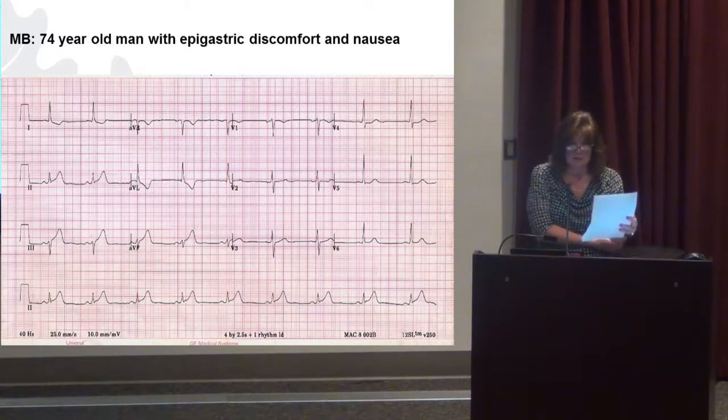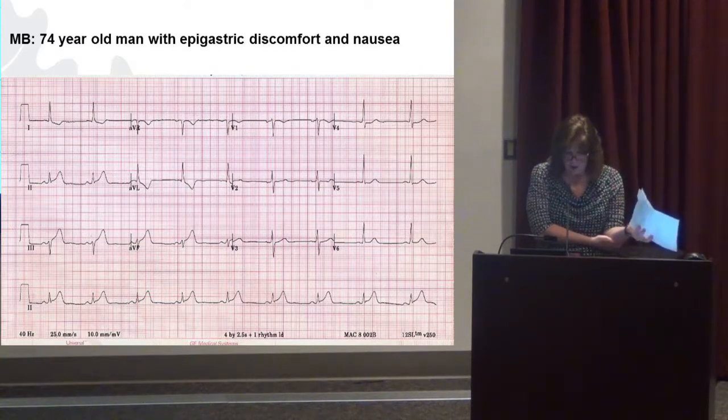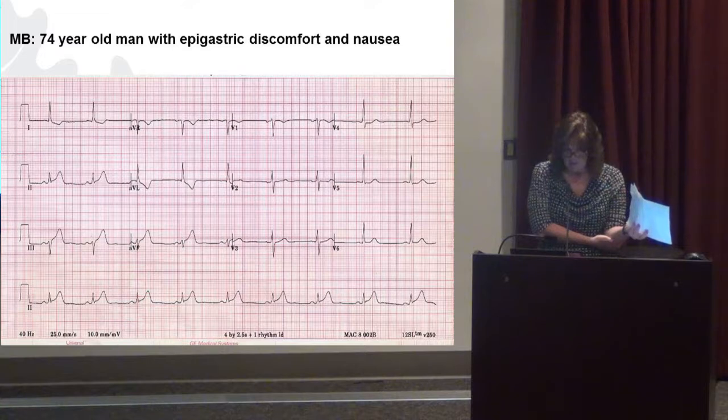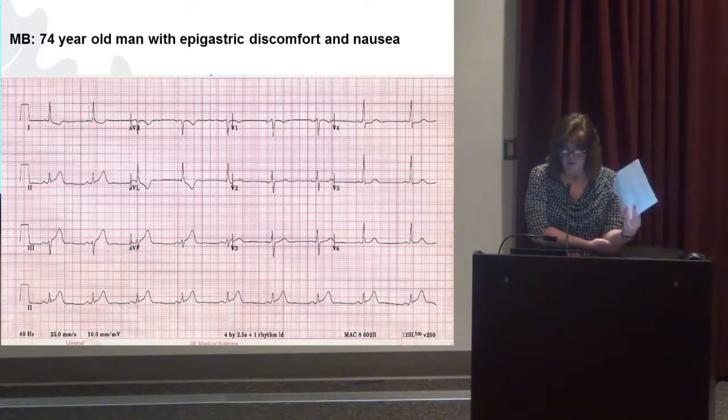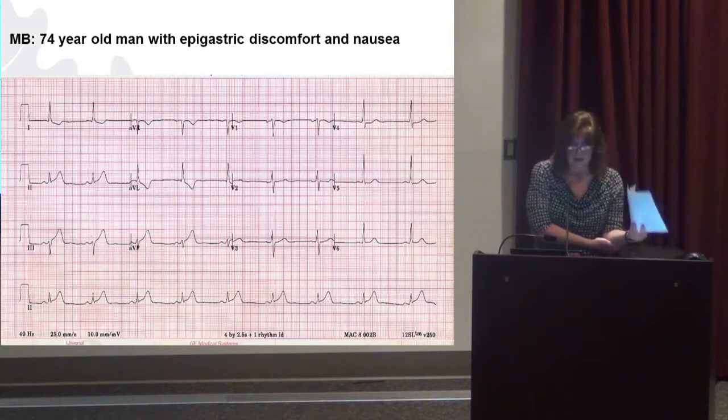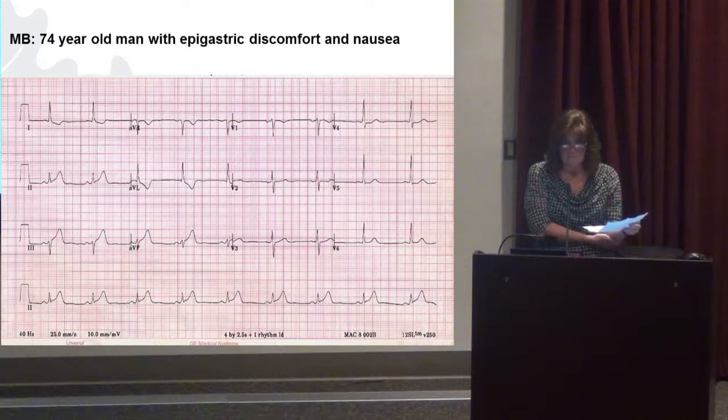So that's on the opposite side of the heart, right? We know that he's got an inferior wall MI, and he's got depression in lead 1. Look at the aVL. It's got the inverted T wave, pretty significant in 1 and aVL. He's also got a little bit of ST depression in, say, V4, right? That ST line is not quite at baseline. So this is an ischemic-looking EKG, MI, and infarct and ischemia.